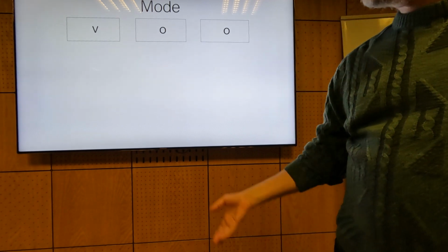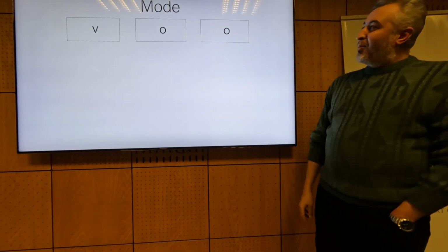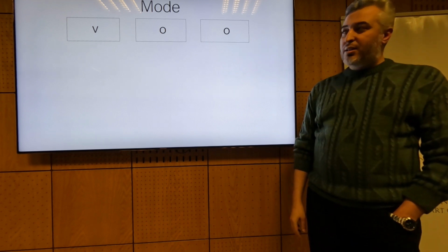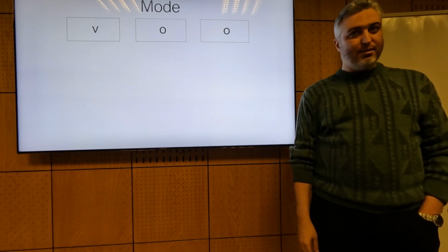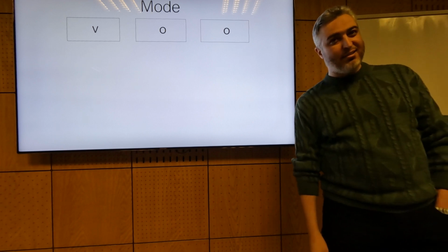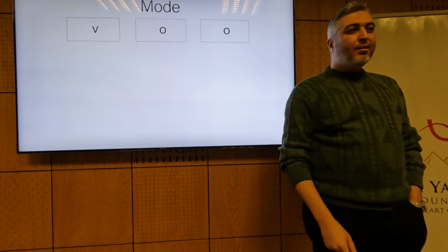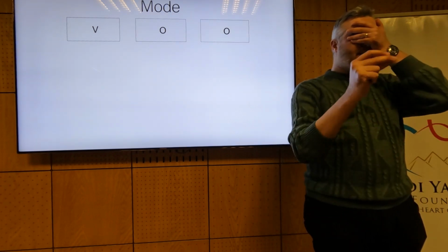Like the AOO, we have another non-useful mode, VOO. So what are we pacing? Ventricle. What are we sensing? None. What is the response to not sensing? Nothing. Again, the pacemaker is connected to the ventricle, has its eyes shut, and keeps pacing at a fixed rate.